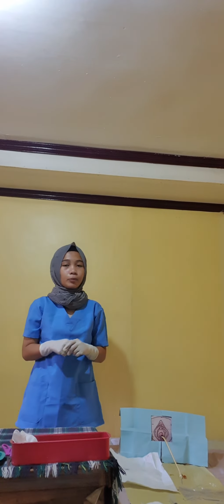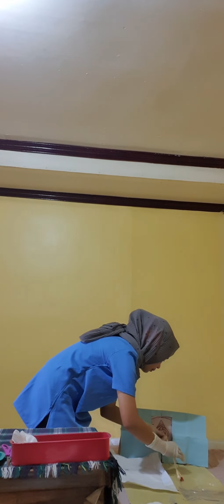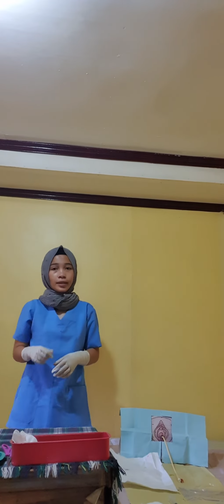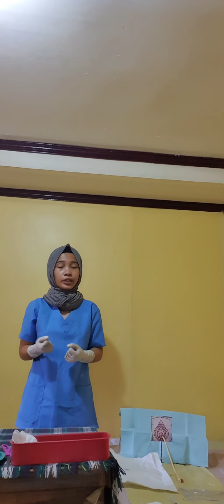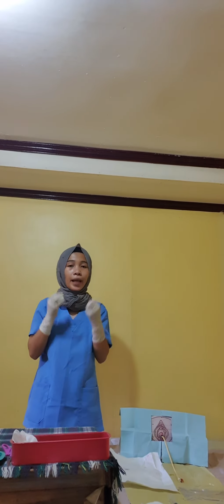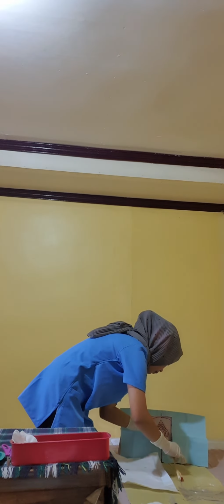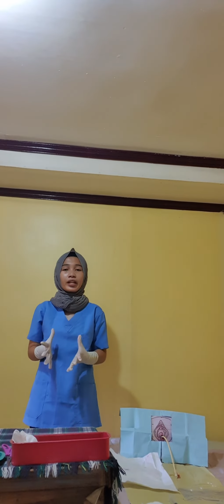So next, slightly pull the Foley catheter. Rationale: to check if the catheter is locked in place. Next, if the lock of the Foley catheter is already ensured, push it 1 to 2 inches further. Rationale: to prevent pressure on the bladder sphincter. So next, remove the drape. Rationale: to access the thighs.